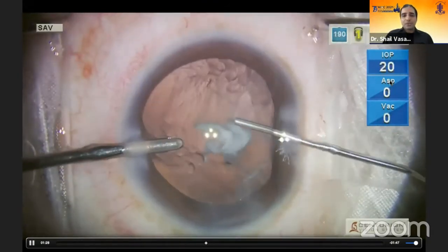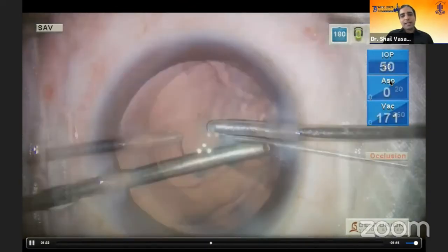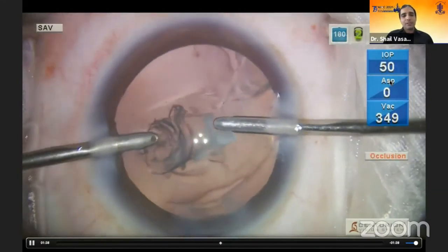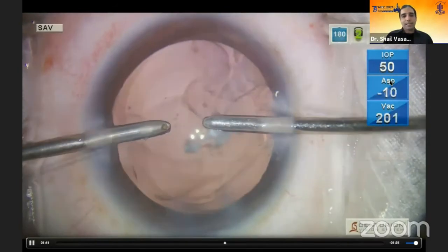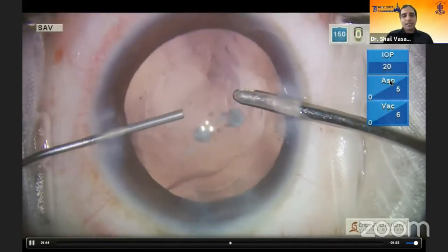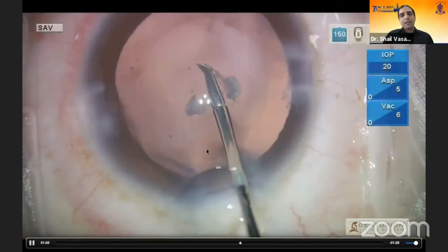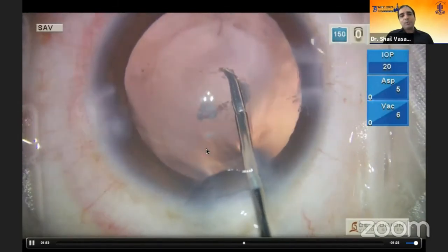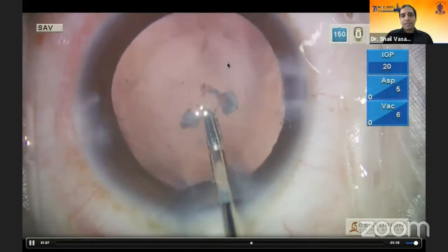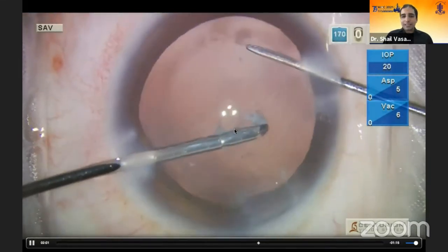Bimanual irrigation aspiration has a distinct advantage — with the peristaltic system you can separate the flow rate from the vacuum. Here I am working at a very low flow rate of 16 to 18 cc per minute, maintaining a closed chamber. Dispersive viscoelastic is the viscoelastic of choice to tamponade the open area and ensure the tear does not extend. You now have this pre-existing tear.